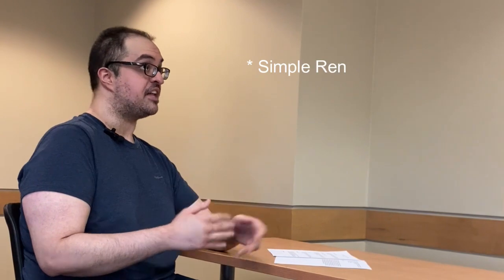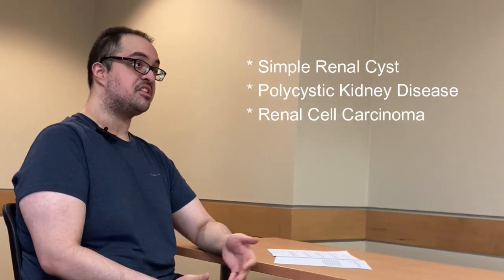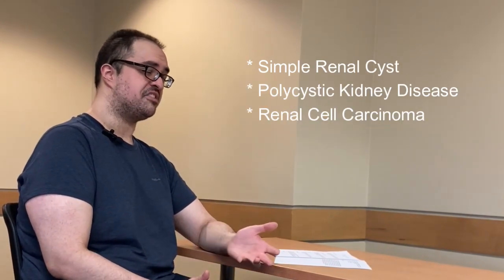Now, possible pathology that you might be able to identify on point of care ultrasound for a patient experiencing lithium-induced renal disease include such confounders as a simple renal cyst, polycystic kidney disease, or renal cell carcinoma. The visualization of lithium-induced renal disease is pretty unique and pretty characteristic.